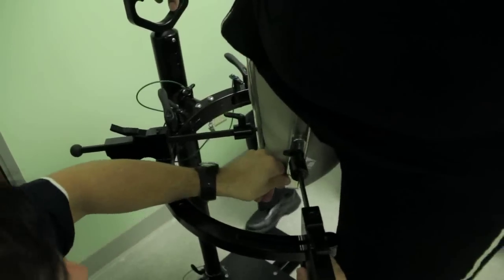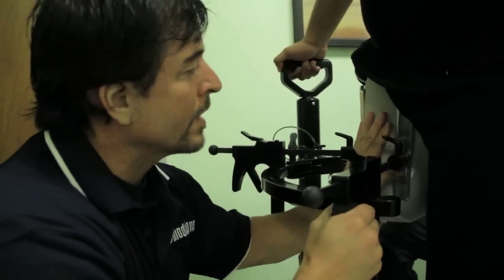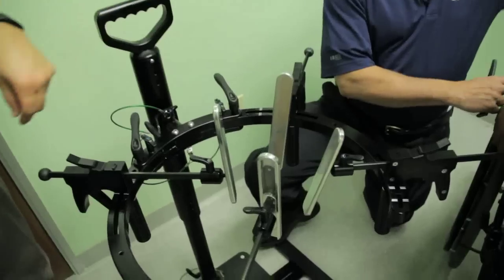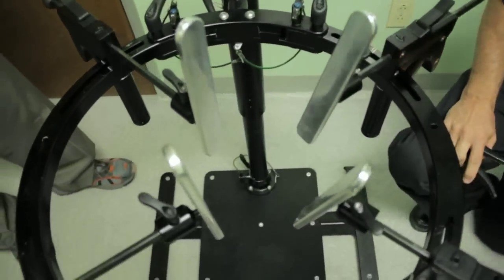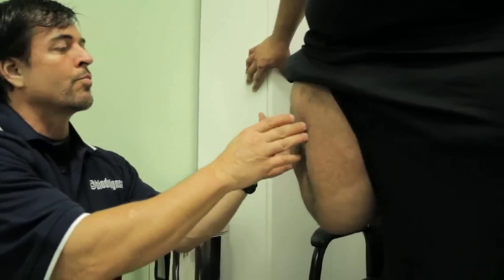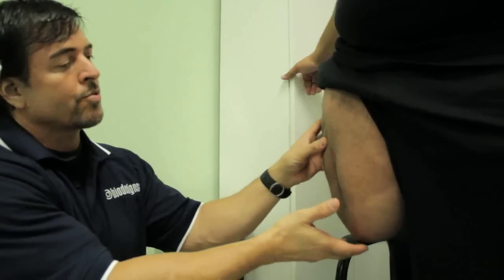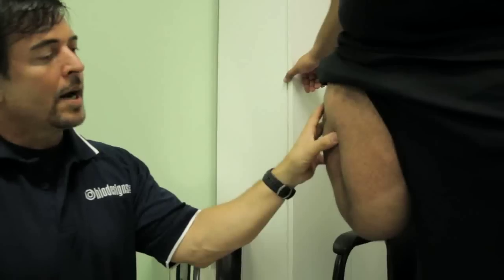Randy's been working with me now getting me fitted with his new high fidelity socket. Hoping that it's going to make a big difference for me in terms of my walking and getting me up out of this chair and getting me a little bit more active. The end of the femur is right there, and what we're really trying to do is control this femur as best we can and just trying to contain the soft tissue. That's a pretty difficult fit.